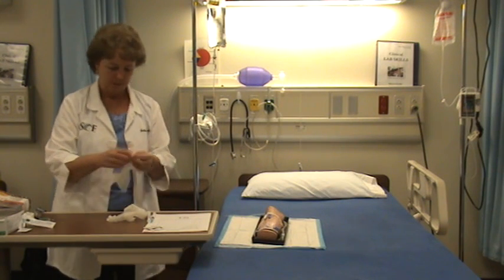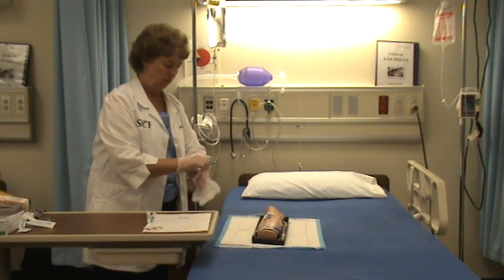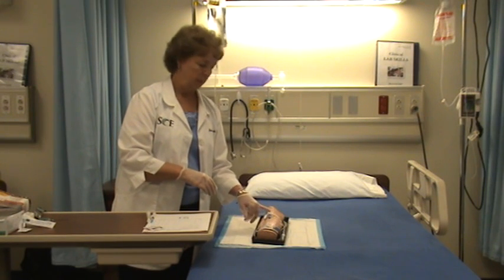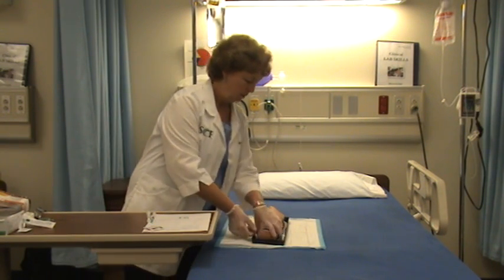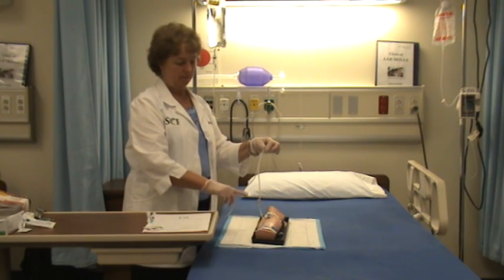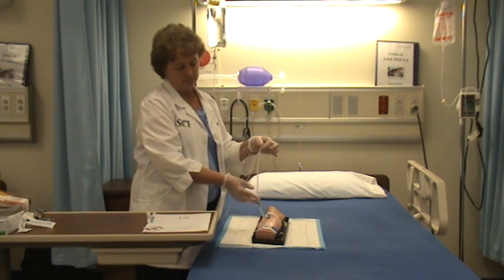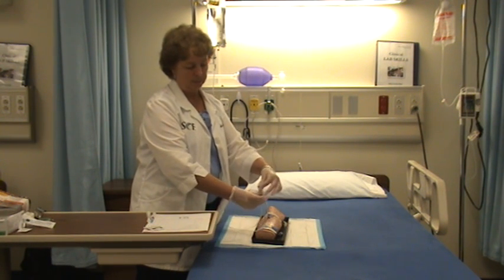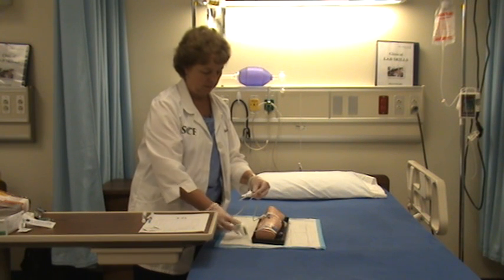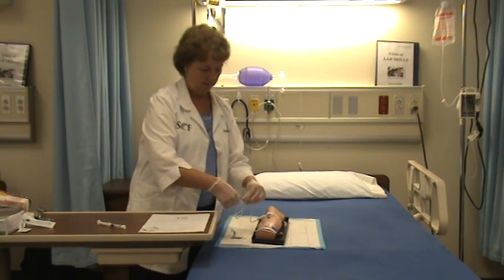I apply clean gloves to protect myself in case the patient has any drainage or the IV site gets dislodged. I've assessed the patency of the IV — it's patent, with no swelling or redness at the site. I'm going to take the port closest to the patient to administer the IV push medication, kink the tubing about this much distance above it, and make a circle to hold it all in one hand. Then I clean the port off with alcohol and put the Lasix in.